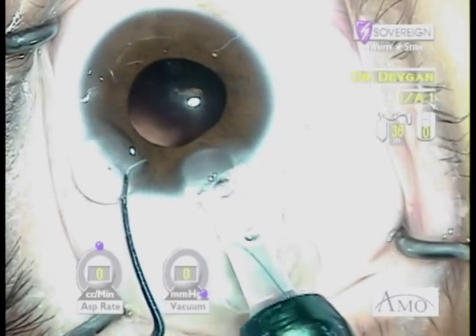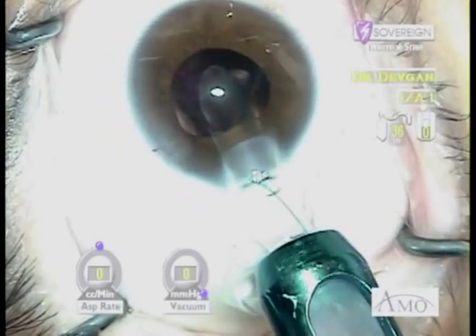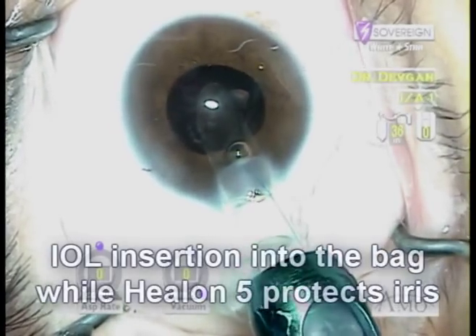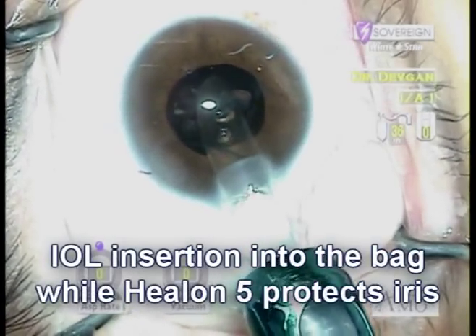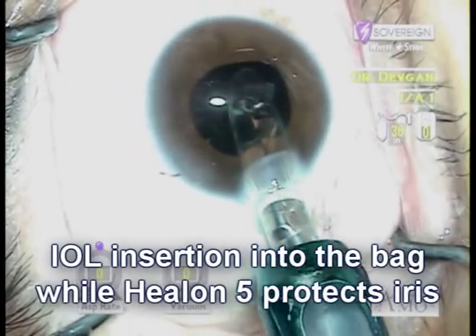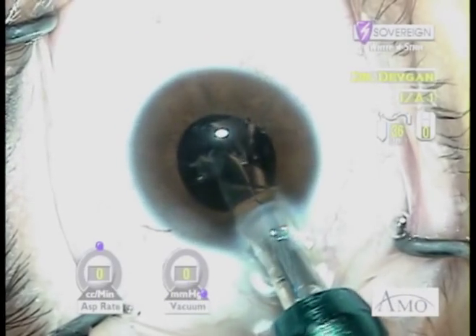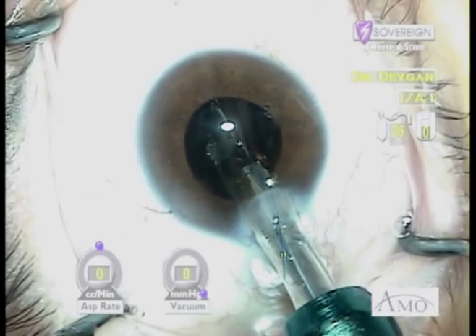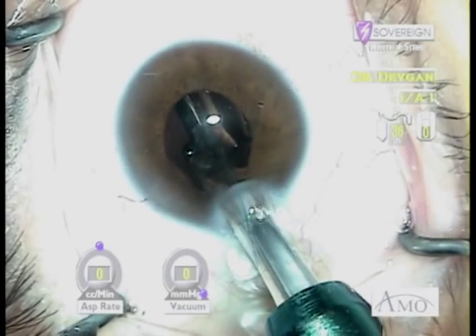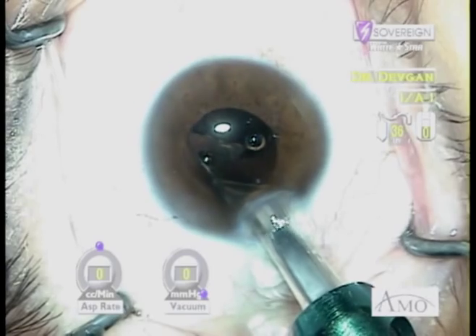We'll go ahead and insert the IOL — don't worry, that small piece of lens nucleus will be removed at the end of the case. The lens goes into the capsule bag very easily because the capsule bag is filled with our normal dispersive viscoelastic that we use on our everyday cases. The Helon 5 plug is virtually invisible but plays its crucial role in preventing iris prolapse.